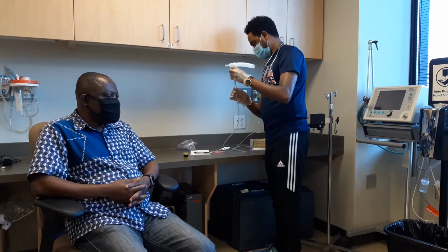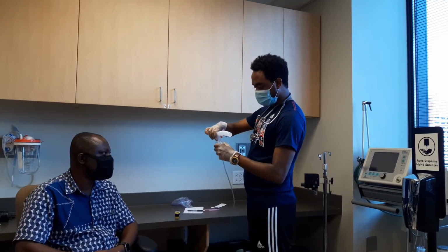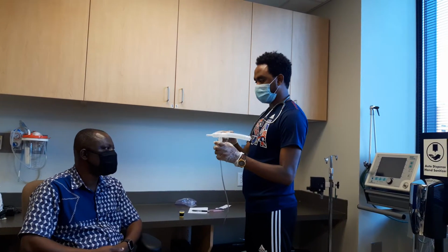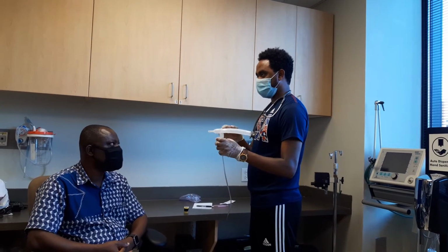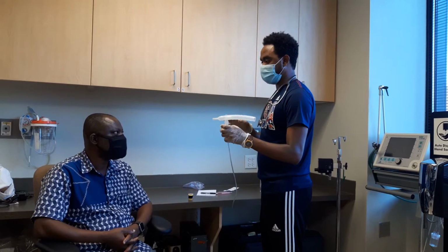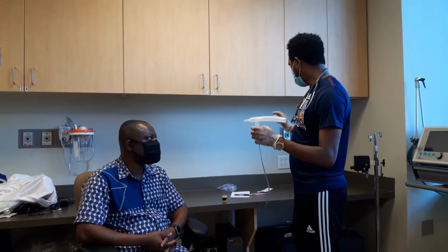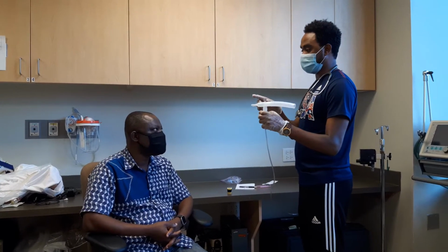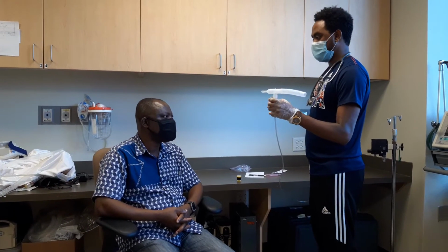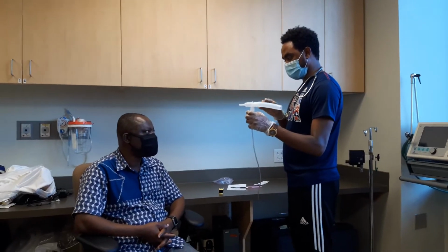Alright, Charles, I'm going to put this mouthpiece in your mouth. Don't bite the mouthpiece with your teeth, and try to close your mouth with your lips closed and tight, and just breathe normally in between. Just keep deep breathing. I'm going to plug in the flow meter, and you're going to see the mist. That's the medication, and in between just keep deep breathing, okay? Keep your mouth sealed.